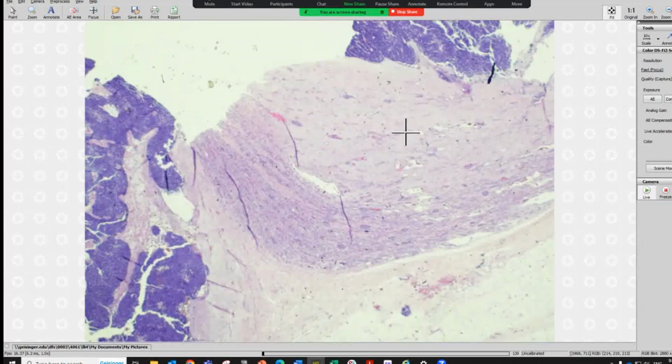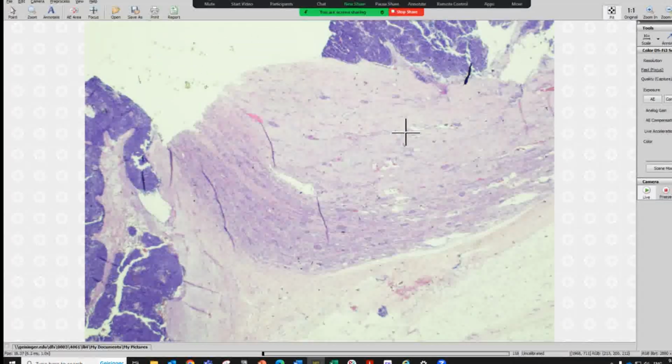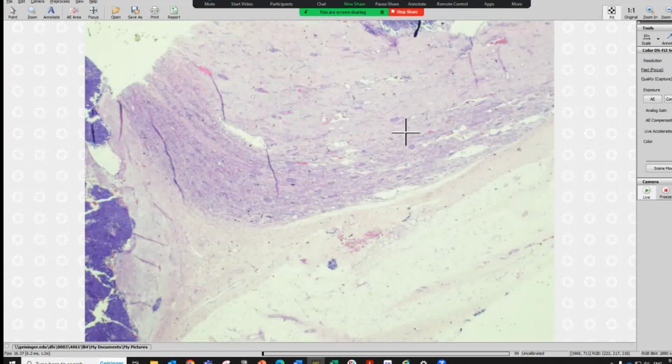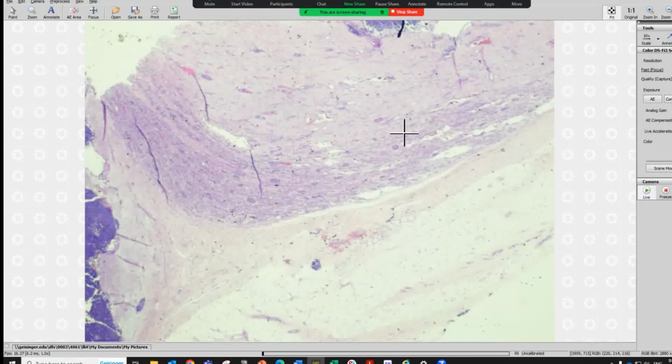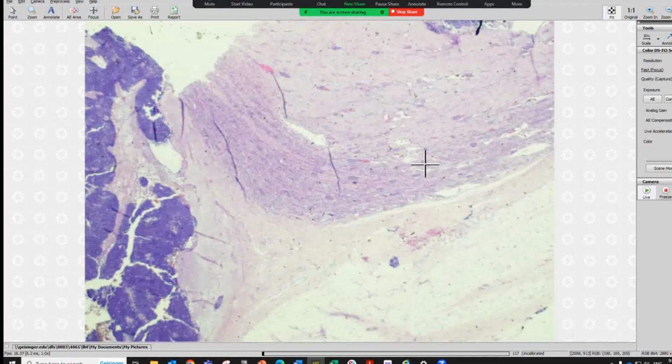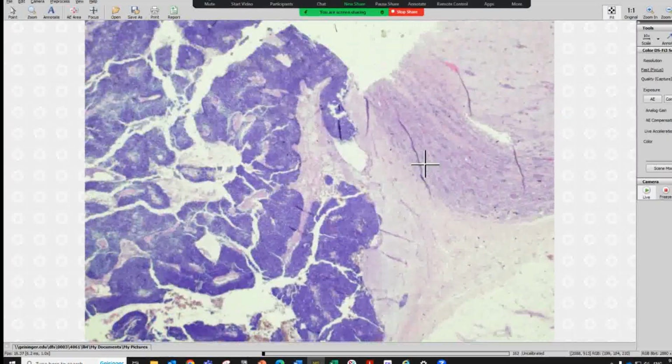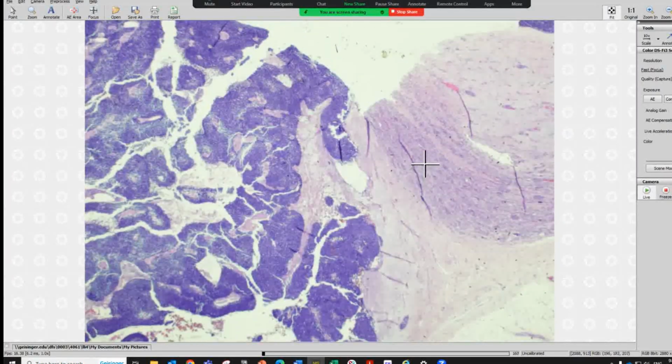So we have some normal kidney here. And this one, I want to tell you, if you use 40X, the normal glomeruli are less than 25% of the high power view. That's less than 1/4. So this kidney is from a baby, maybe 2 years old. I couldn't remember the history exactly. So we know this is a baby.